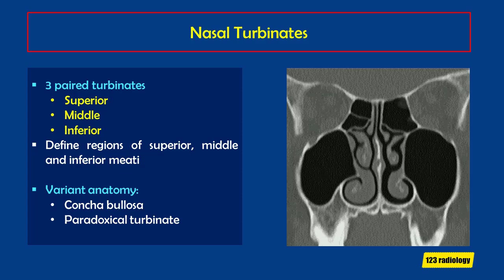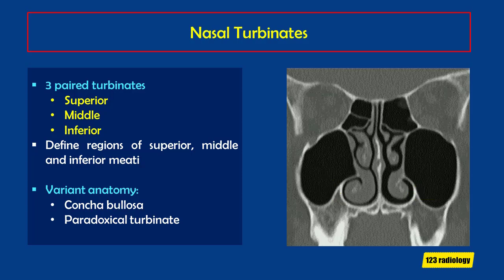Inside the nasal cavity, we have three pairs of nasal turbinates: the superior turbinates, the middle turbinates, and the largest, the inferior turbinates. These turbinates are important not just for humidifying air and acting as a filter, but they also define three distinct regions — the superior, middle, and inferior meati — which are important as part of sinonasal drainage pathways.